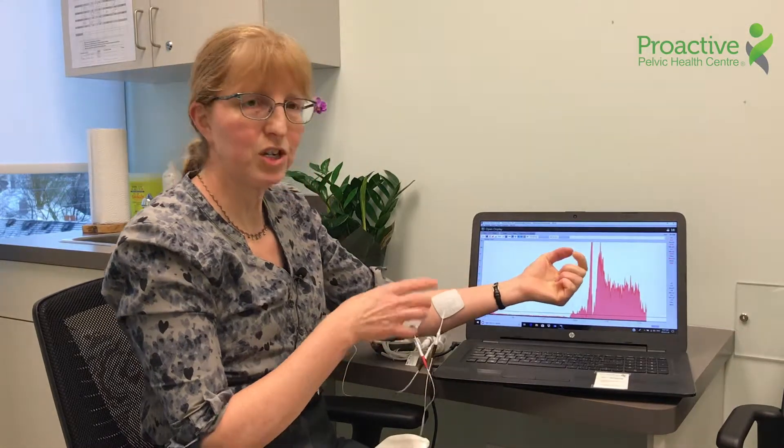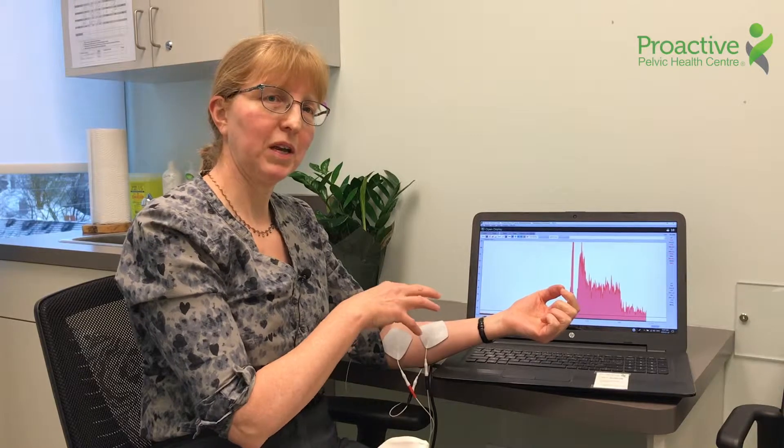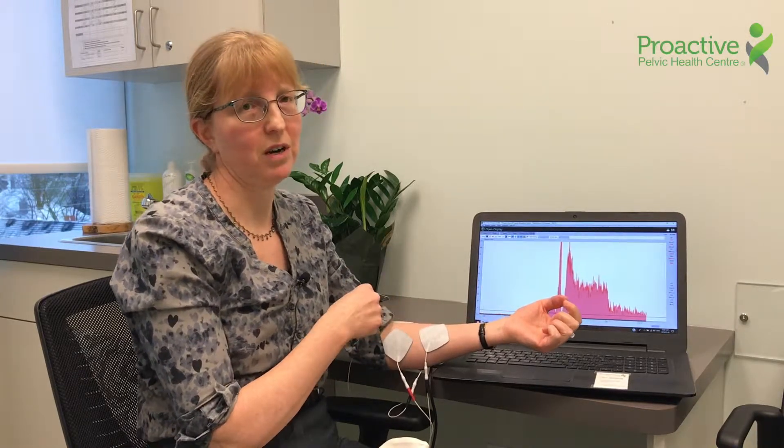There's no energy going into me, there's no electricity. This is all about picking up the electricity that my muscles generate. So biofeedback can be a really useful tool in the clinic.